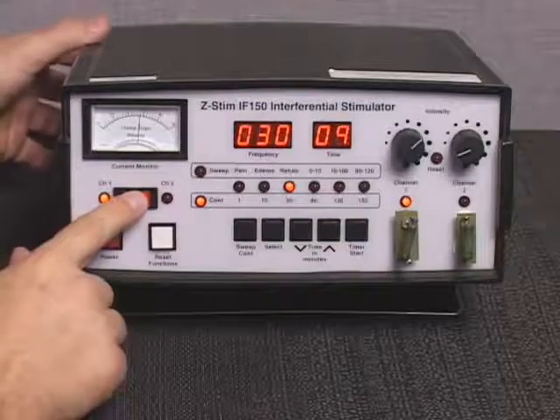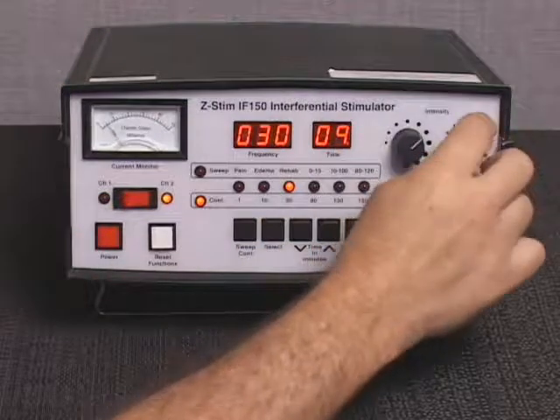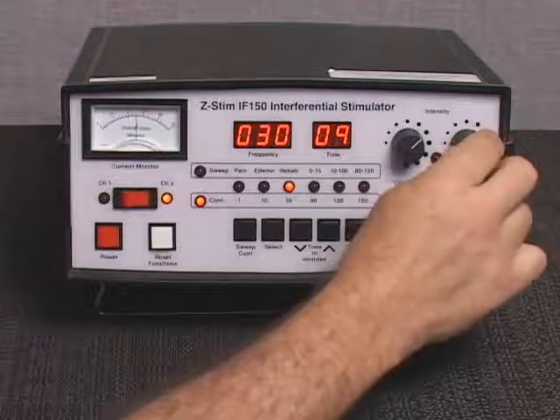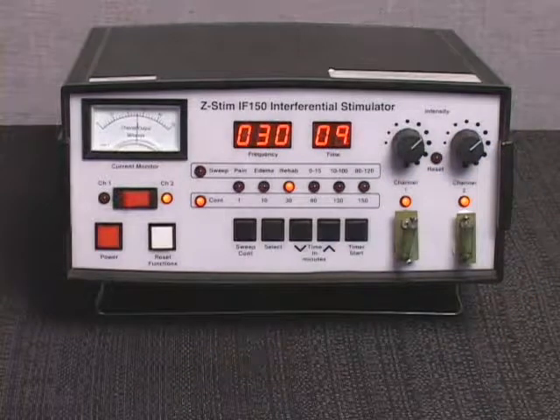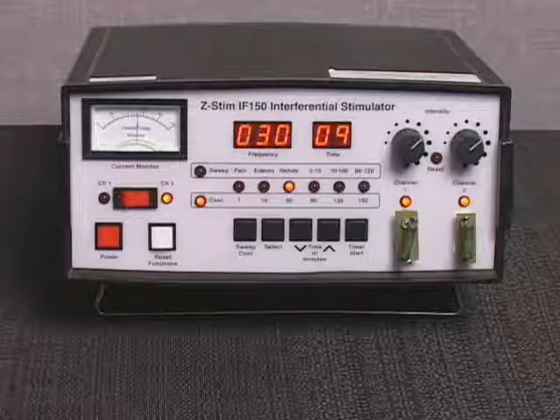Press the right side of the current monitor channel selection control. The current monitor indicator light for channel 2 will illuminate and the current monitor will display the output for channel 2. Slowly increase the intensity control for channel 2 to the desired output level. The current monitor will indicate the output intensity selected for channel 2.